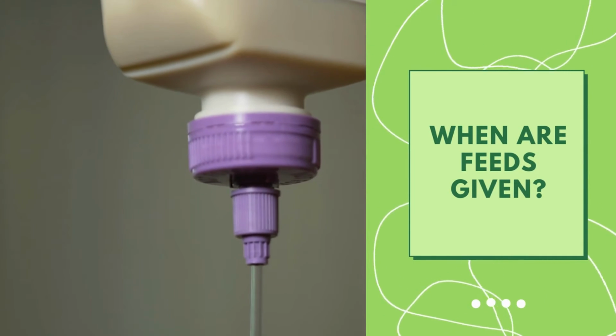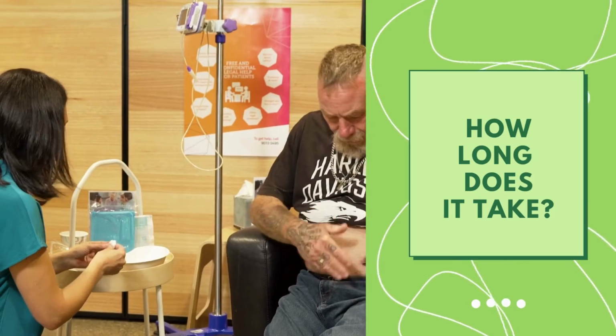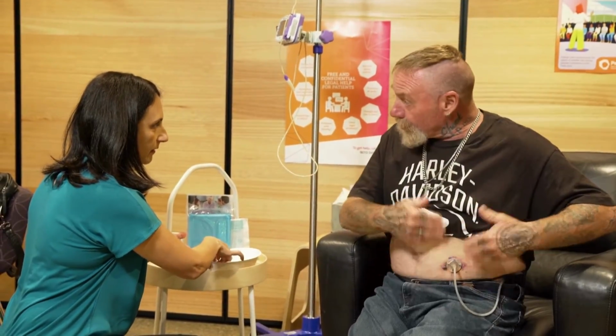Feeds are given daily, usually at night time, and the reason we do it at night time is so that you can have freedom during the day and not be attached to your pump and your pole. A feeding can take generally between 10 to 12 hours because we know that most people want to get about 8 hours sleep.